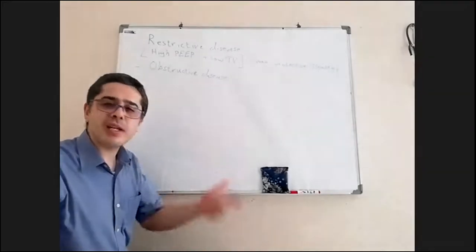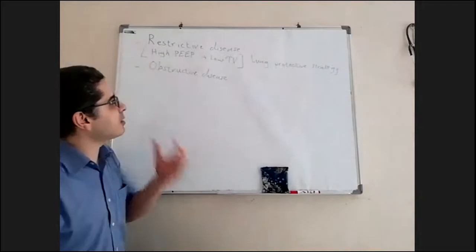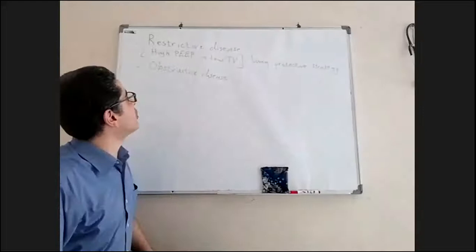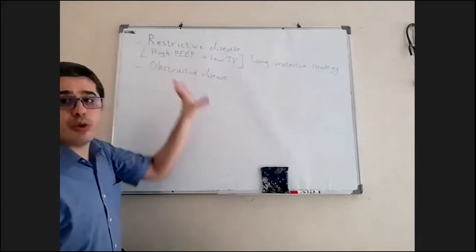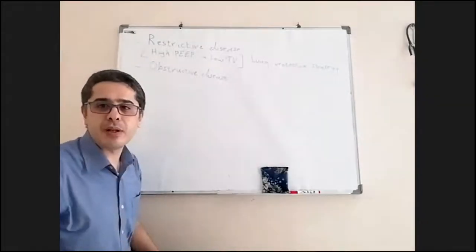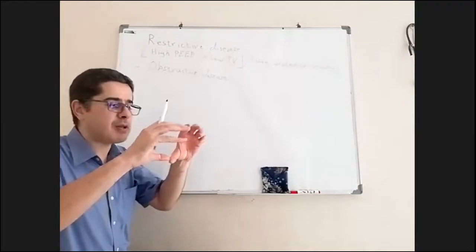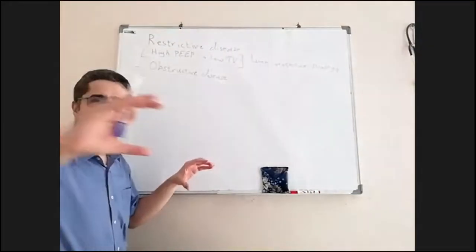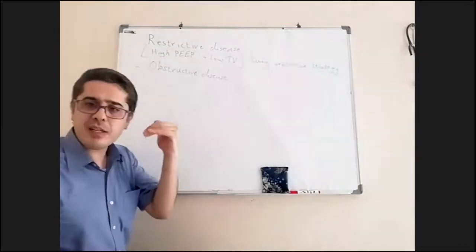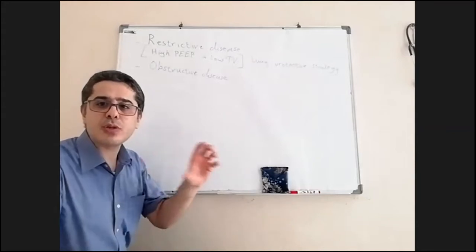Because that will cause inflammation and the release of pro-inflammatory markers, which can lead to lung injury. So that's why they found it is good when you use the PEEP, so you keep the lung open. And as we know, last time, PEEP improves functional residual capacity. It keeps the airways open and the alveoli open. It is not injurious to the lung. It is continuous pressure.